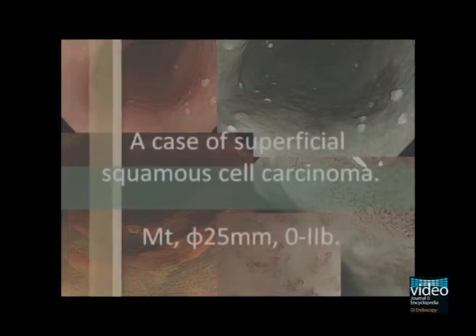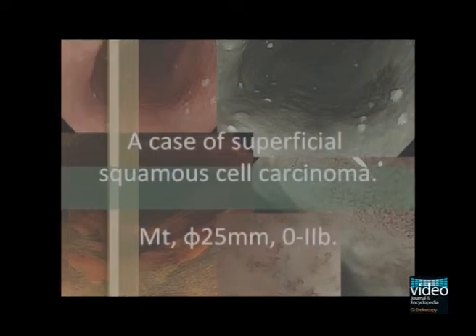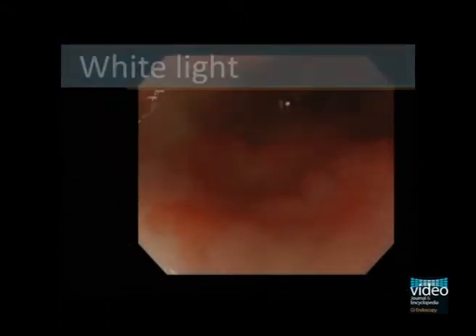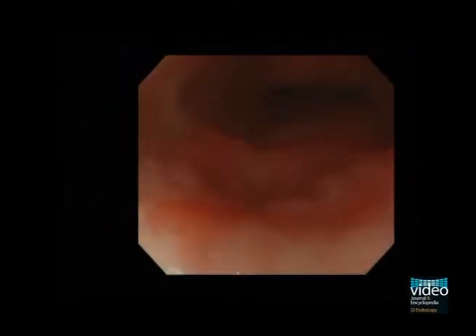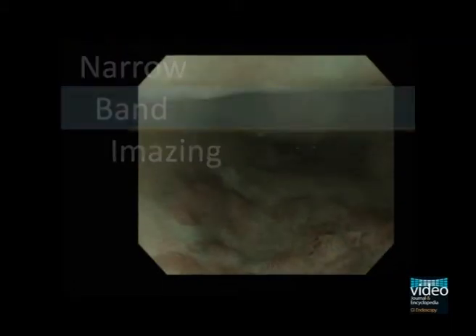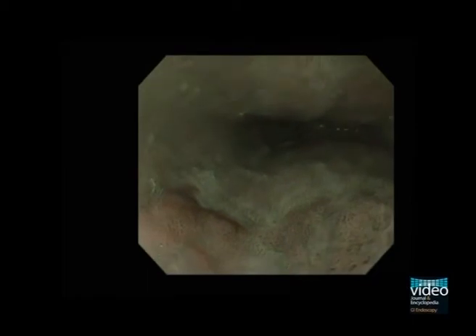We present a case of an esophageal squamous cell carcinoma. The lesion is mainly flat and reddish in white light endoscopy. Narrow band imaging, that is NBI, shows a brownish area.